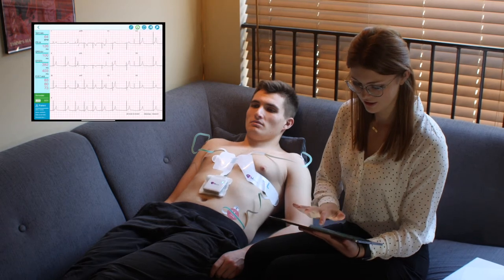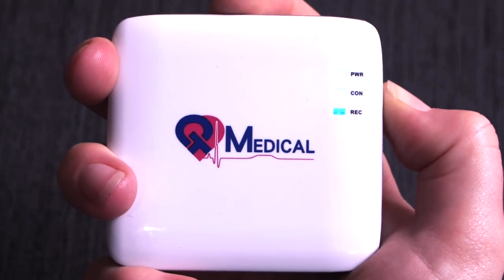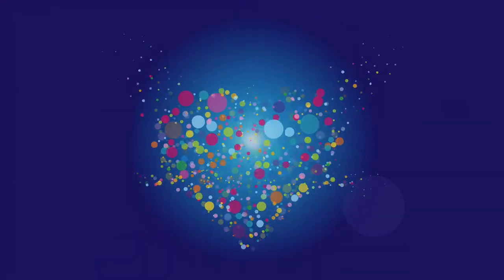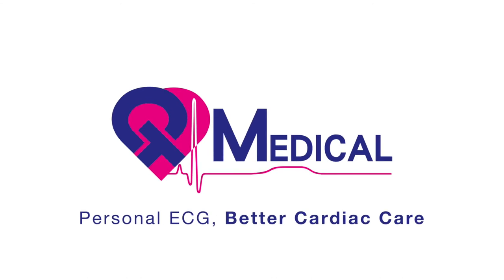Once the ECG is completed, you can view your preliminary report by clicking on this icon. To turn the device off, hold the power button for about 5 seconds or until the lights turn off. Congratulations! You have just completed a QT-ECG test in the comfort of your own home.